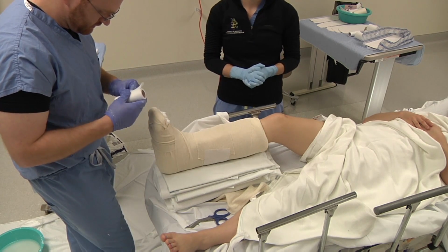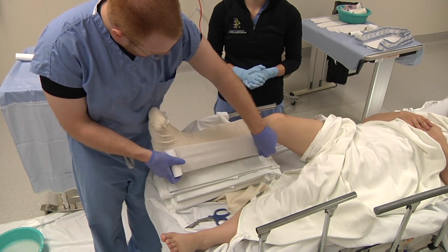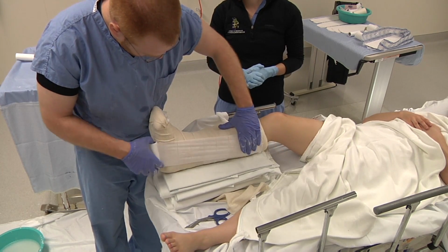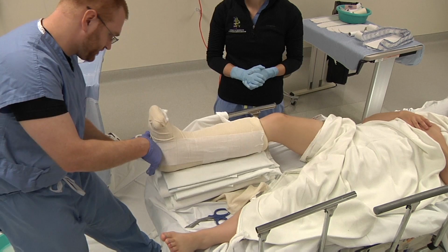Post-splinting, in the case of any neurovascular changes after your splint has been applied, it may be advisable to remove the splint to evaluate for any areas of compression.